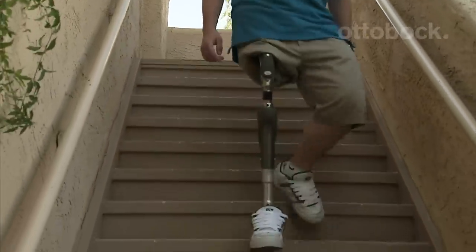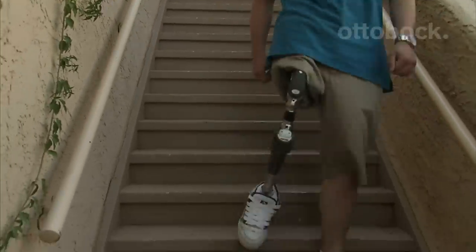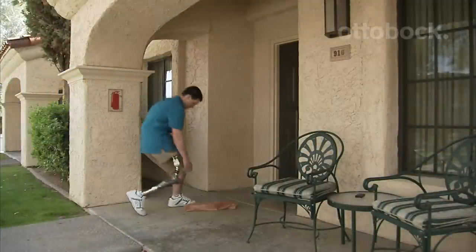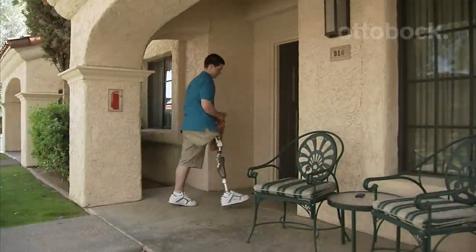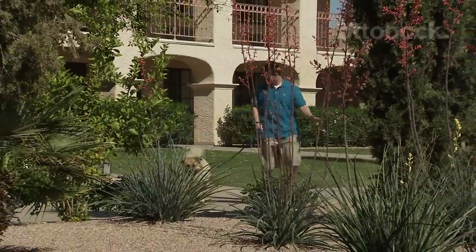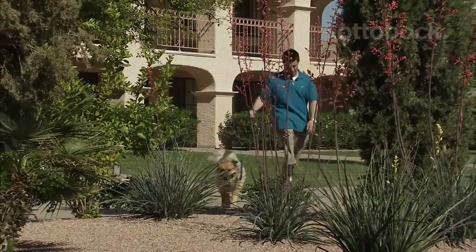This totally unique hip joint makes it easier to take on stairs and ramps step over step. It gives you remarkable range of motion, making it easier to tie your shoes, get into a car, and complete other daily tasks. And most importantly, it helps improve walking while minimizing your risk of falling.